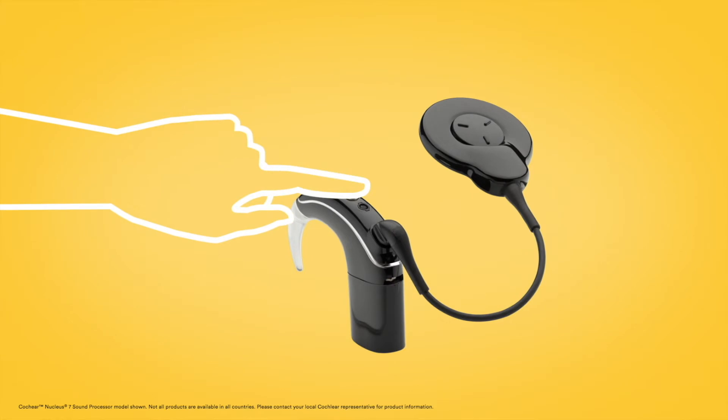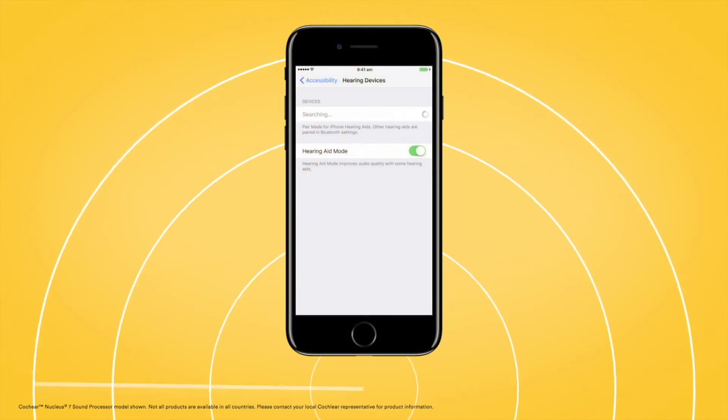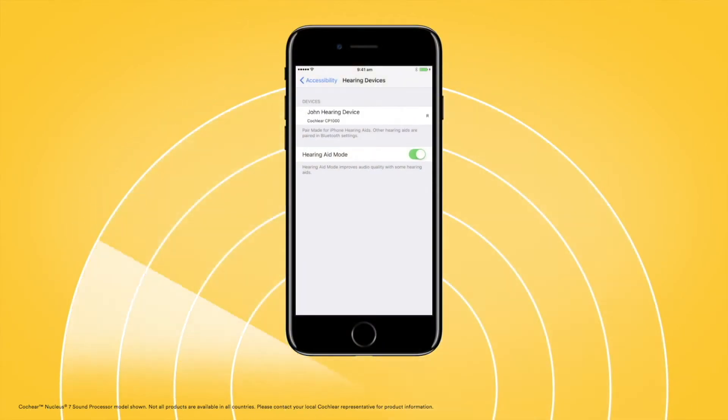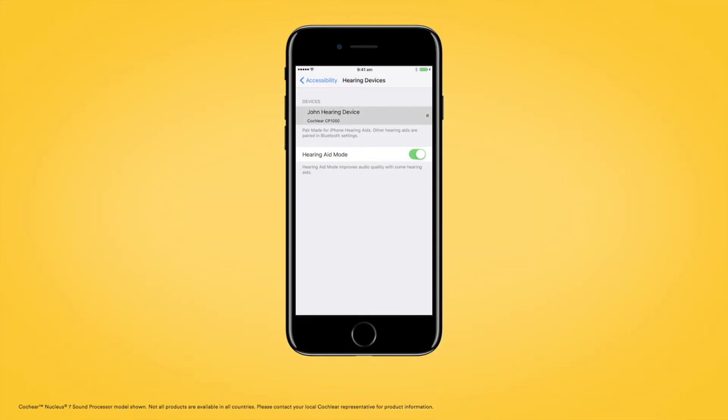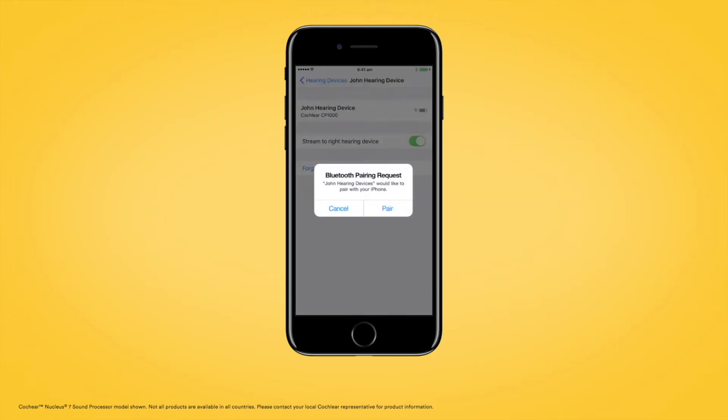Next, turn your sound processor off and back on again. Your Apple device will then search for your processor and display it in the Devices section. Select the name of your processor and tap Pair.